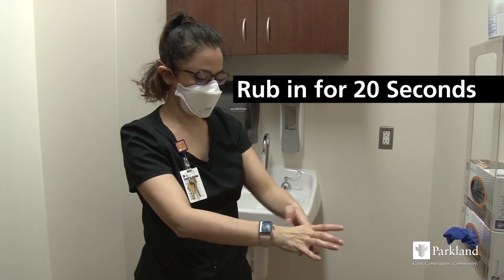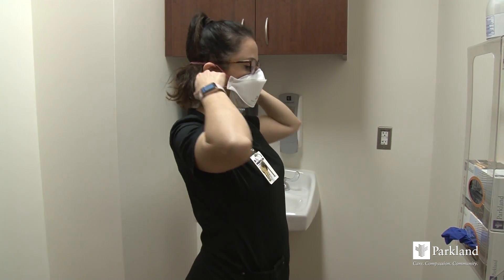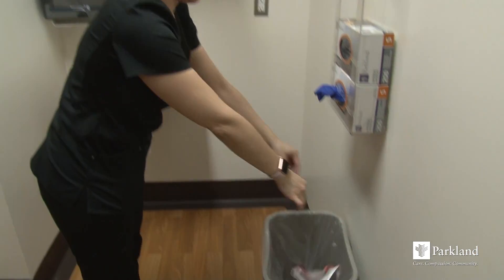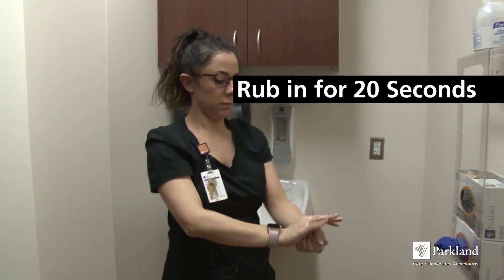The front of the respirator is contaminated — do not touch it. Grasp the bottom strap and then the top strap, and continue up and over your head. Discard in the waste bin and perform hand hygiene one final time.